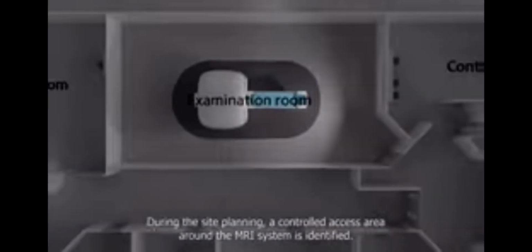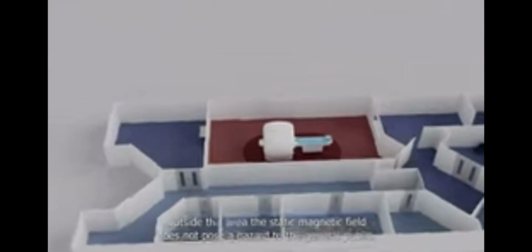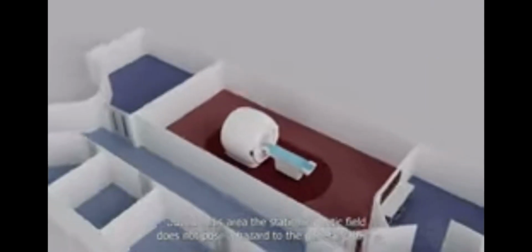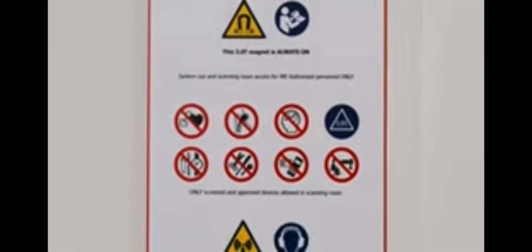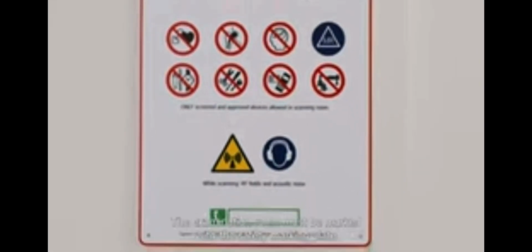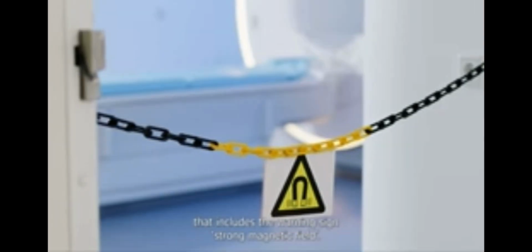During the site planning, a controlled access area around the MRI system is identified. Outside this area, the static magnetic field does not pose a hazard to the general public. Inside the controlled access area, there is a potential hazard. For most sites, the controlled access corresponds with the examination room. The examination room must be marked with the safety marking plate that includes the warning sign, Strong Magnetic Field.